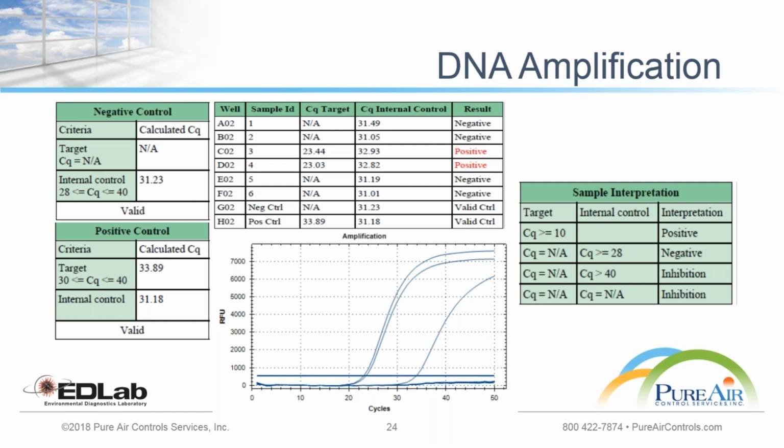So sometimes it ends up as a false positive in a scenario where we are hunting for a viable Legionella. But nevertheless, this is a very important method, especially when we are running against time, and it will give us good information to determine the next stage.